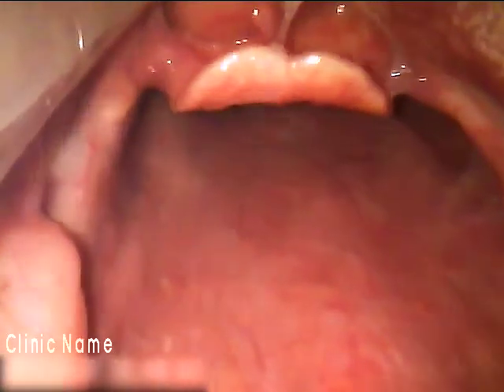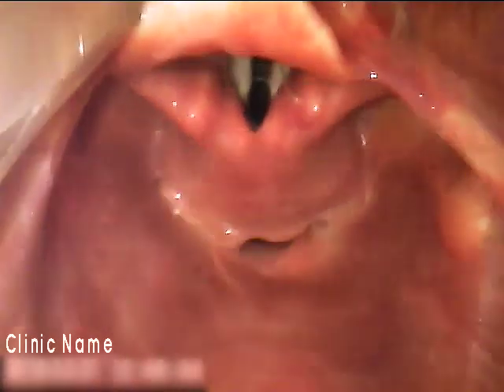Inexperienced users of video laryngoscopy often place the laryngoscope blade too deeply and bypass the larynx. The tissues are often unrecognizable. In this case, as the video laryngoscope blade is withdrawn, we now see the larynx and the epiglottis.